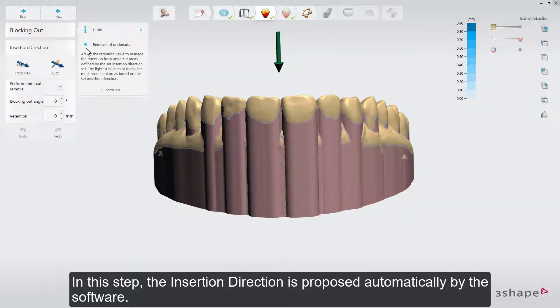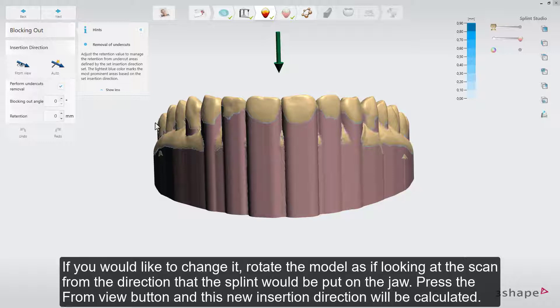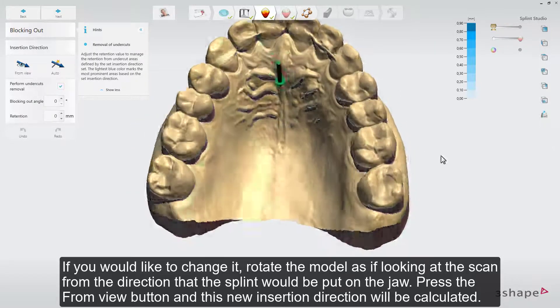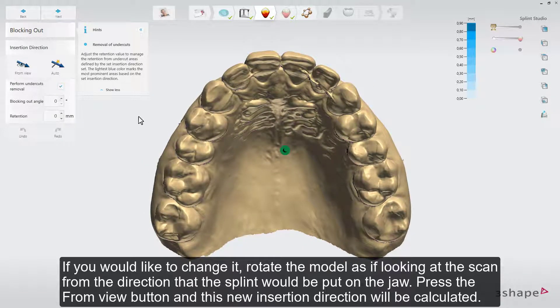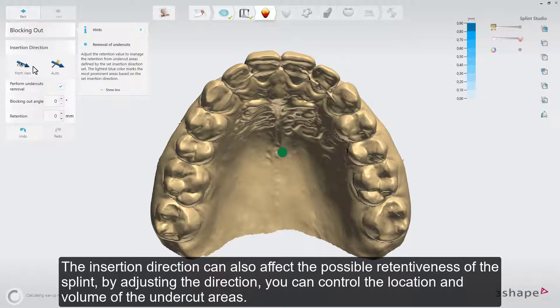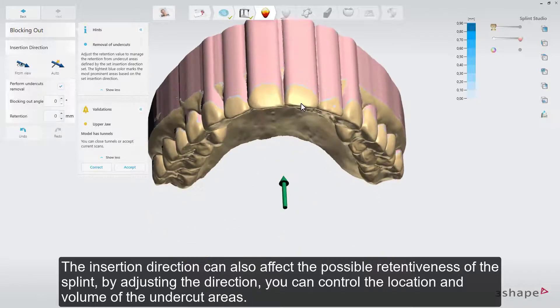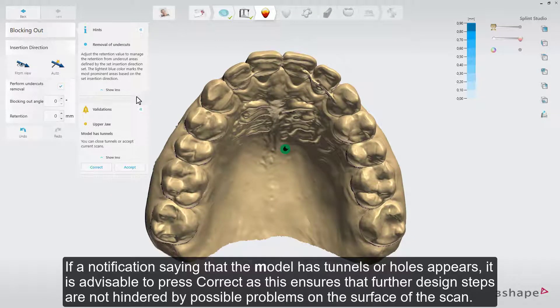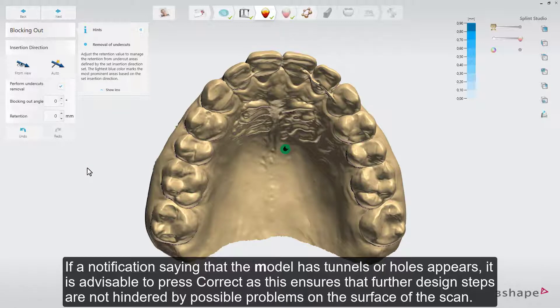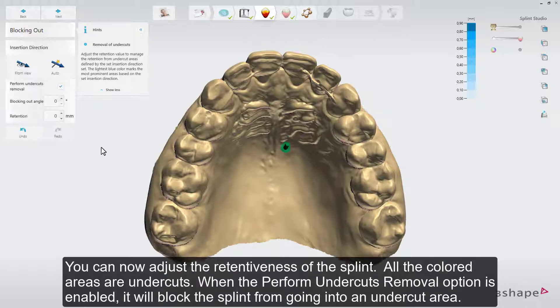In this step, the insertion direction is proposed automatically by the software. If you would like to change it, rotate the model as if looking at the scan from the direction that the splint would be put on the jaw. Press the From View button, and this new insertion direction will be calculated. The insertion direction can also affect the possible retentiveness of the splint. By adjusting the direction, you can control the location and volume of the undercut areas. If a notification saying that the model has tunnels or holes appears, it is advisable to press Correct, as this ensures that further design steps are not hindered by possible problems on the surface of the scan.